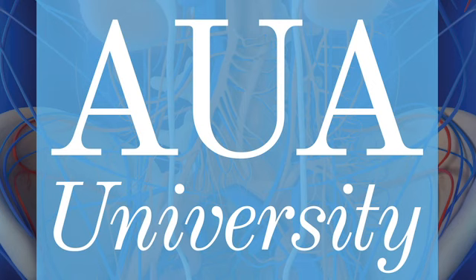Urethral dilation. If dilation is necessary, as in for urethral stricture or bladder neck contracture, serial dilation or balloon dilation can be performed. If hydrophilic S dilators are used, it is critical to confirm that the wire is in the bladder to avoid dilation of a false passage. This can be done by passing an open-ended ureteral catheter, 5 French, or the smallest, 8 French S dilator over the wire. With correct positioning in a patient in urinary retention, urine should drain upon removal of the wire. Alternatively, ultrasound can be used to visually confirm the presence of the wire in the bladder.